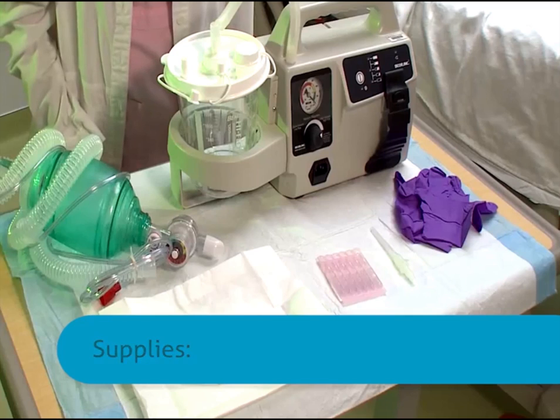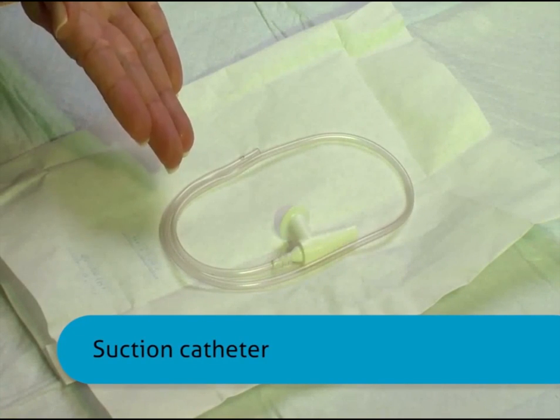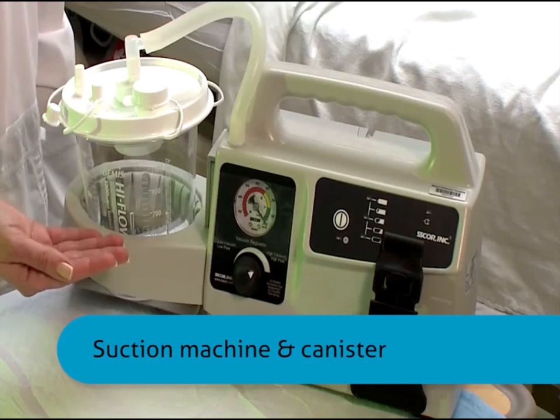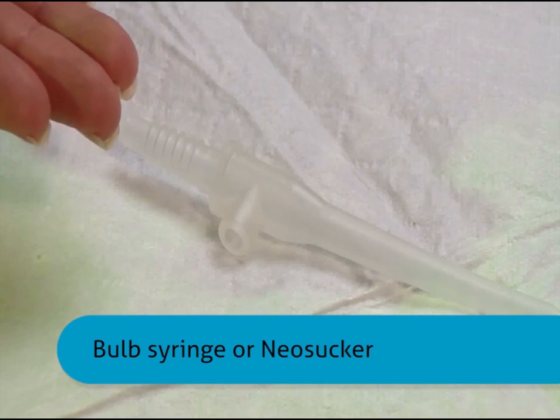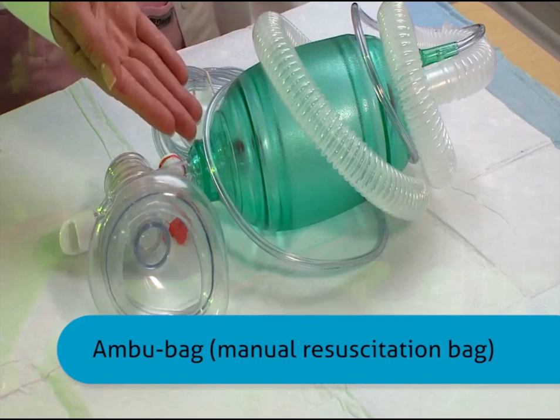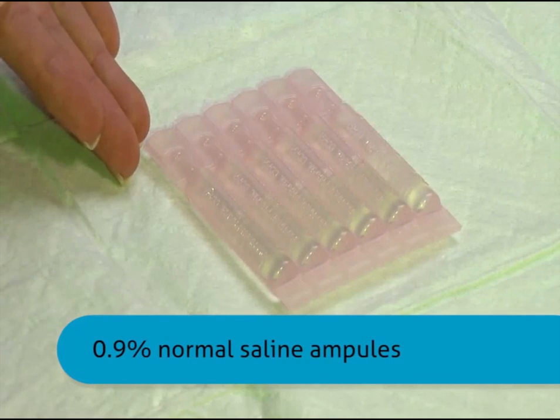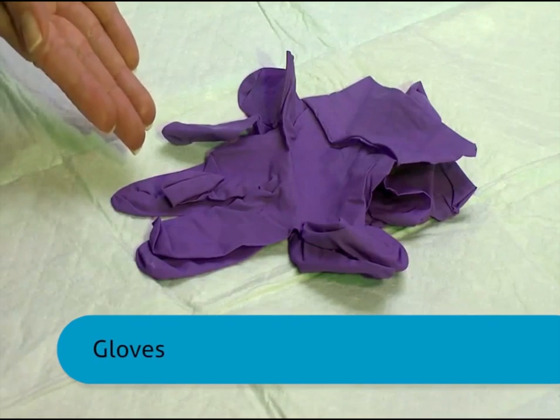For this procedure, you will need a suction catheter, appropriate size based on tracheostomy size, a suction machine and canister, a bulb syringe or neosucker, an Ambu bag, 0.9% normal saline ampoules, and gloves.